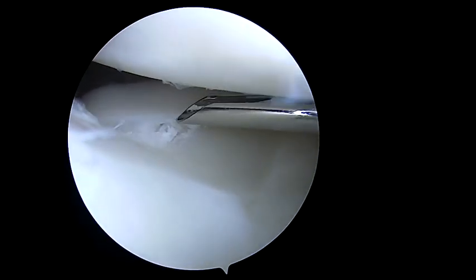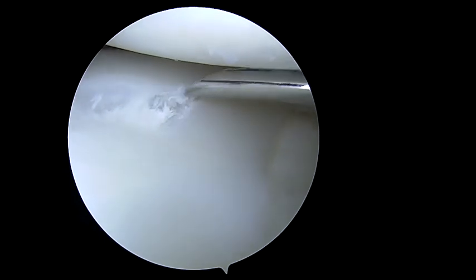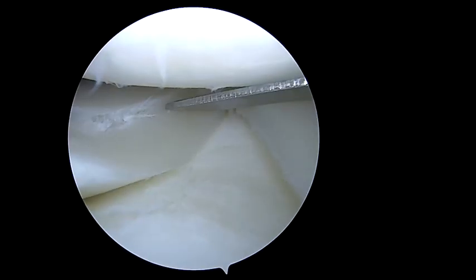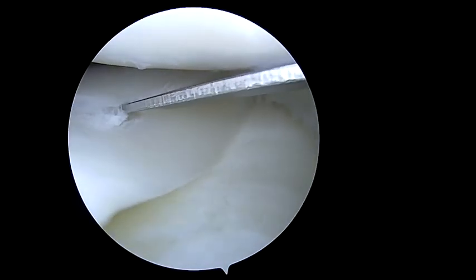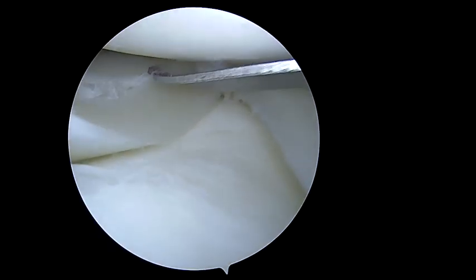With the patient in figure of 4 position, an approximately 20 millimeter longitudinal tear of the lateral meniscus was visualized. Initially, you can see the inability of the all-inside suture device to access the peripheral aspect of the lateral meniscus tear due to obstruction from the lateral femoral condyle. An arthroscopic skid was placed through the anterolateral portal.